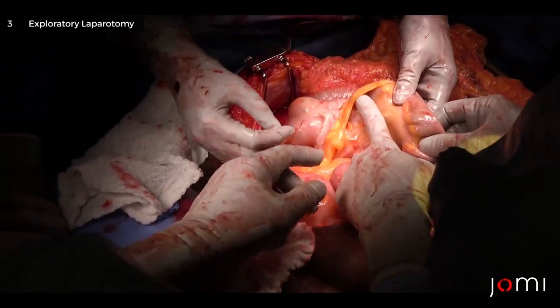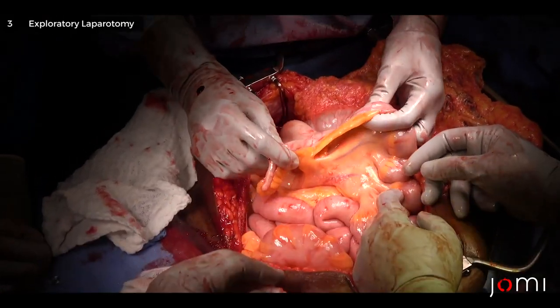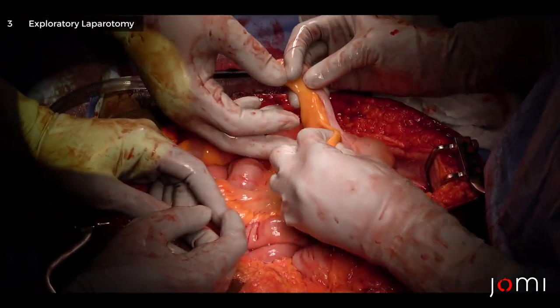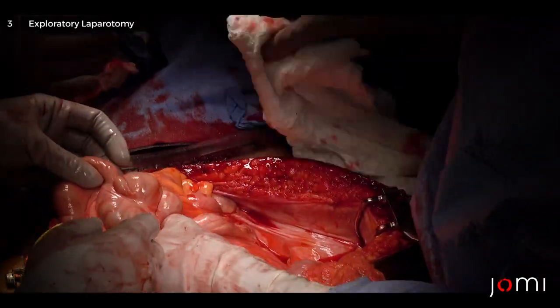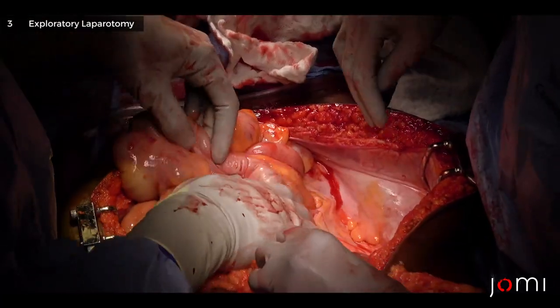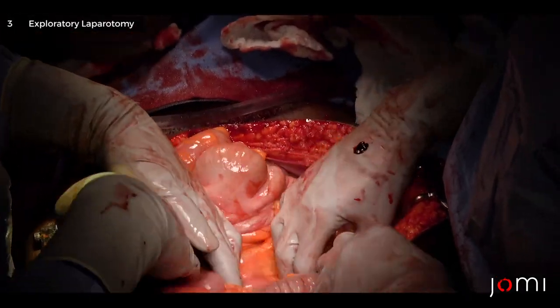Now with the terminal ileum — what are we going to find here? The appendix — the appendix is there. A fat pad — the fold of Treves (T-R-E-V-E-S). Now we're going to sweep up the ascending colon.